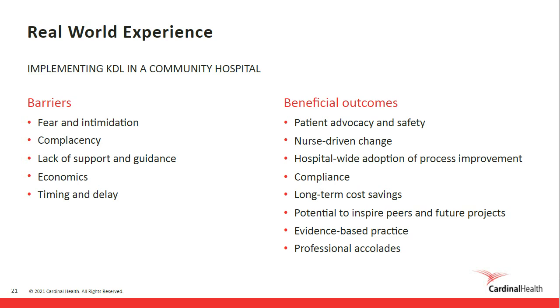Okay. And you were anticipating attendees' questions beautifully. This next question was about whether when you transfer patients from the ICU to telemetry, does their single-use cable travel with them, or do you grab a new one? So it sounds like it stays with them. Yes, definitely. We do want to be as cost efficient as possible, and we also recycle our leads.